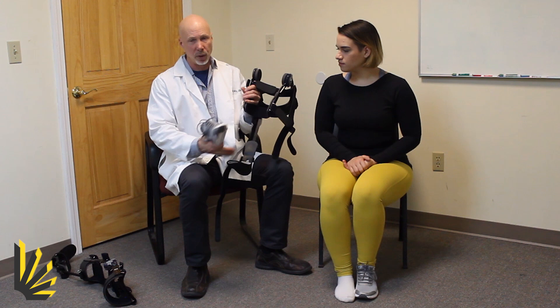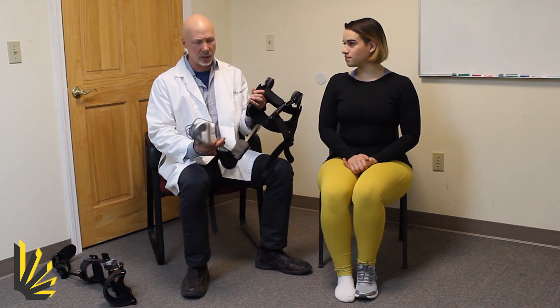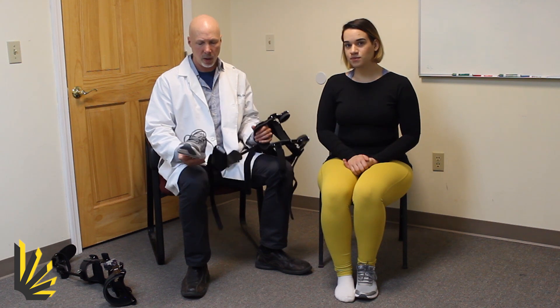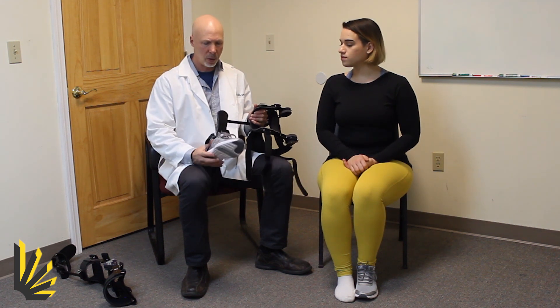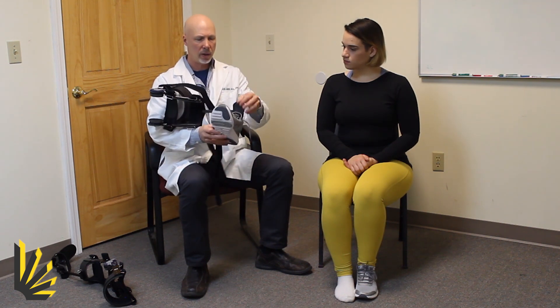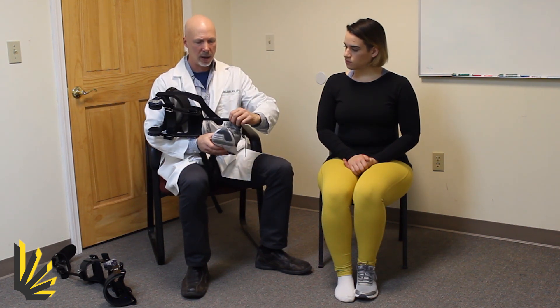As you can see, the Mastid Knee Brace comes with no extra charge — the foot section — and this is what prevents the brace from falling down. Simply put the foot section into the shoe and then put the foot into the brace-shoe combination.